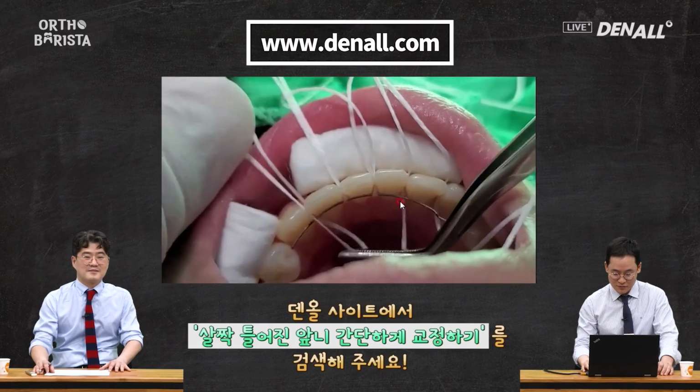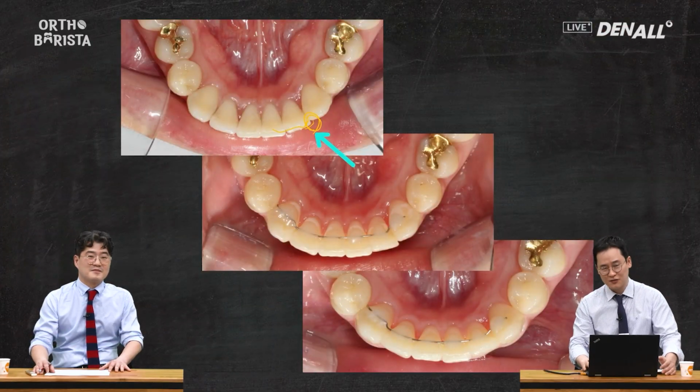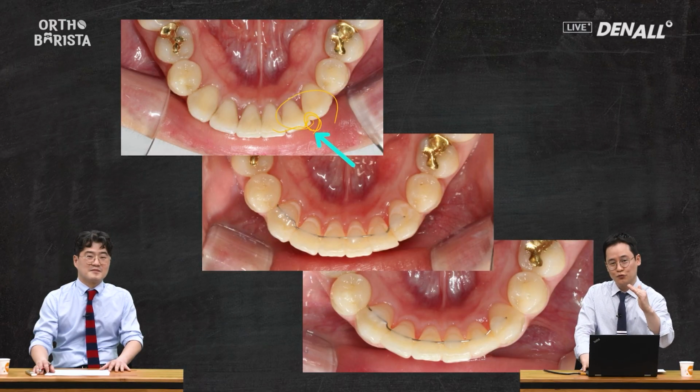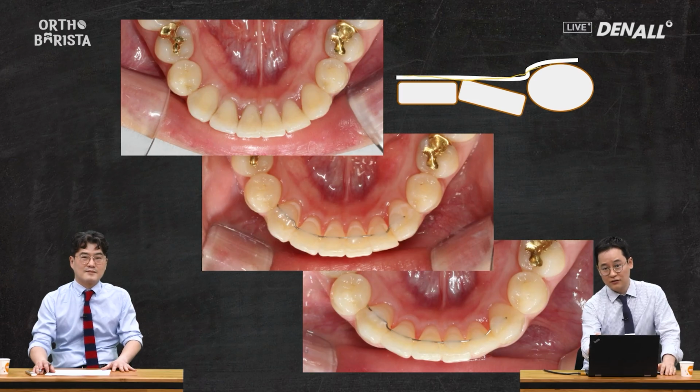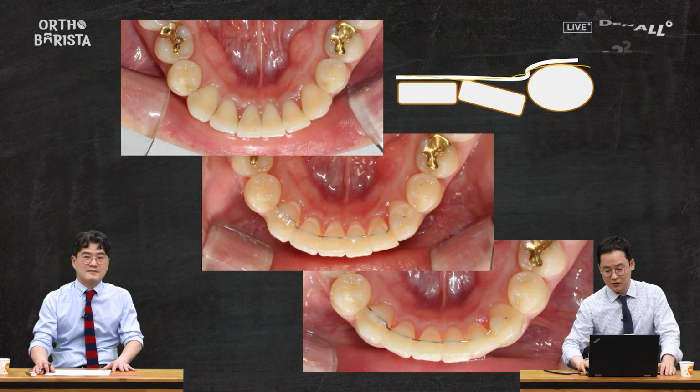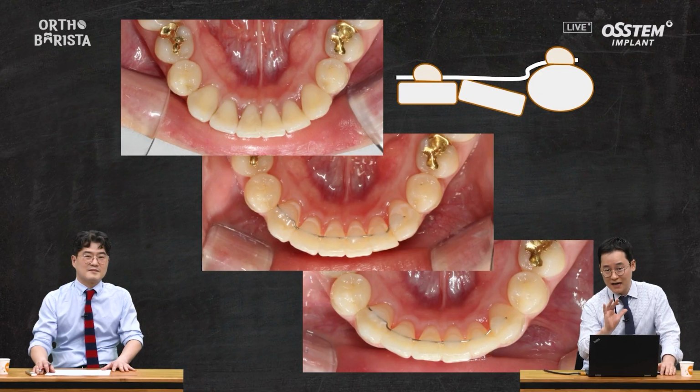To explain briefly, for teeth that barely move, say only about 1, 2 degrees or even 5 degrees, you can position a nickel titanium wire. It's okay to add a little bending if necessary. After that, you attach resin to the tooth surface. And make sure to apply Vaseline to the wire itself. The Vaseline is applied to the wire before bonding the resin.